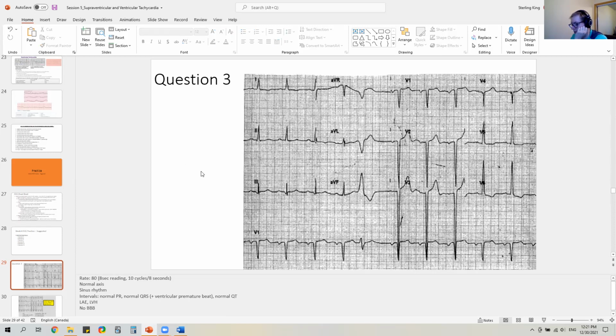All right, so now we're going to go through our scheme for Q waves, ST segments, T waves. So let's start with the lateral, and then I'm going to have a piece of paper. Actually, I'll draw it on the computer so you can see it. So checking lateral for Q waves, there's no Qs in 1. Don't see any Qs in aVL, and I can check over in V5 and V6 to make sure. Doesn't look like we have Q waves. So no Qs. It's lateral. No Qs.